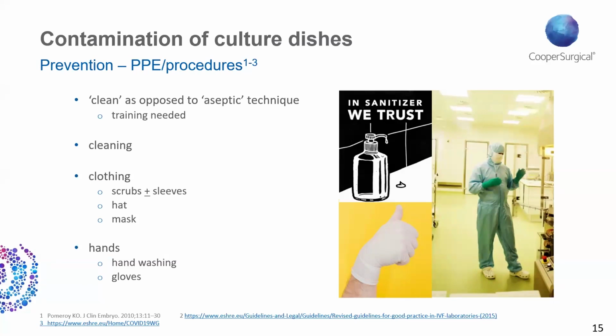But adequate training in the best techniques is important. How we clean the lab, when we clean the lab, what materials we use can also play a major part. And the use of ethanol or IMS should be avoided at all times during the working day. You can use it at the end of the day, but certainly not during the working day.